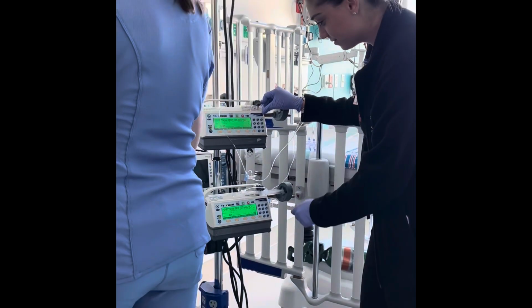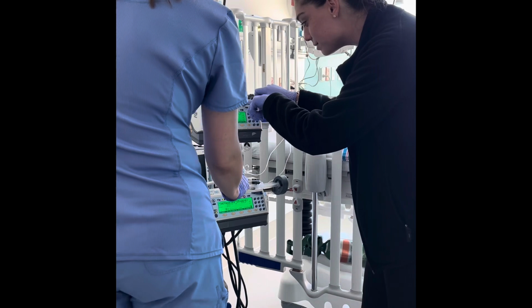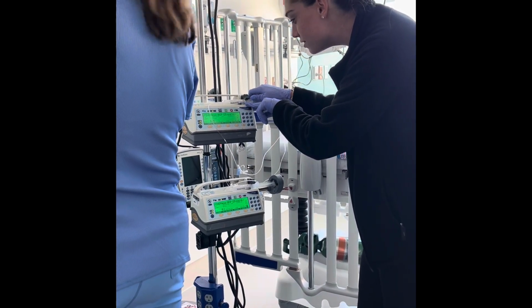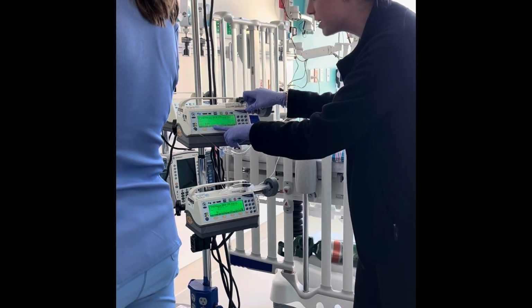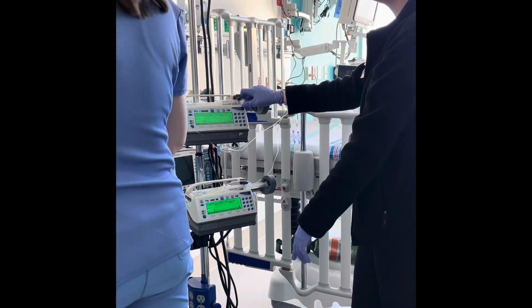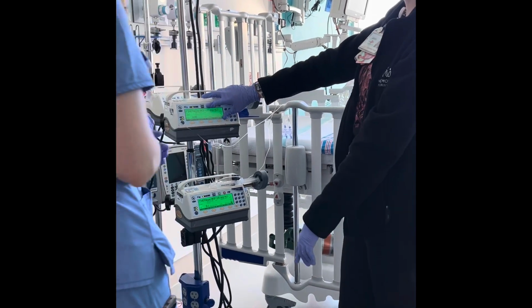So they'll do the independent double verification and they will notify the provider that they are going to be initiating. 1, 2, 3, double 4, 5, 6, 7. This is epinephrine, 25 mics per mL. Weight is 10 kilos, dose 0.05 mic per kilo per minute. Rate is 1.2 mLs an hour. Correct. All right, so you may start the infusion at 0.05.